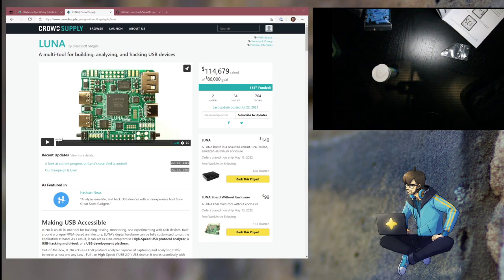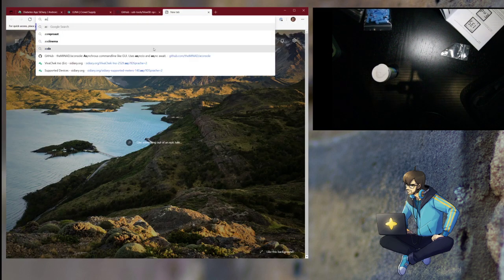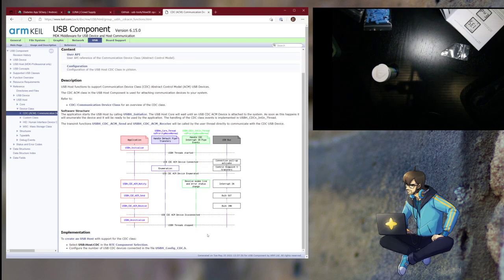It sounds like my next step for this part of the project is to figure out how to get the data out of this thing, which is the end target. But to get that, I will probably need to write the protocol for ACM, and I don't know how that actually works. So, CDC ACM protocol. Somebody will probably have written something. Oh, look. Keil has something.